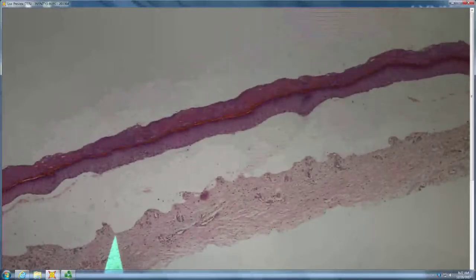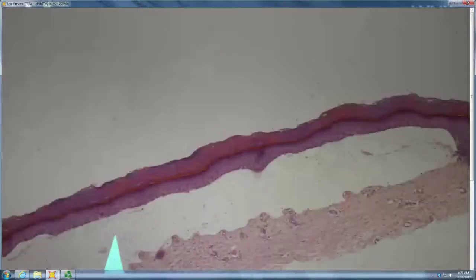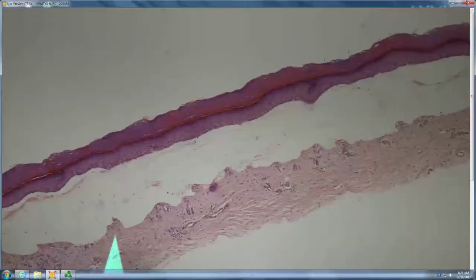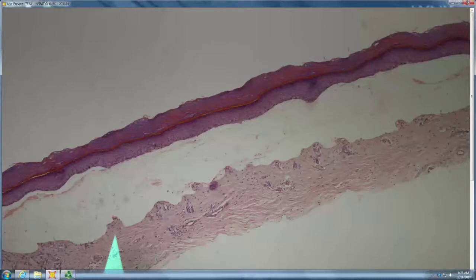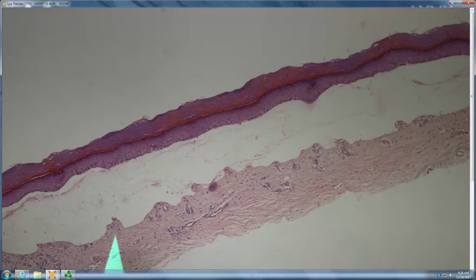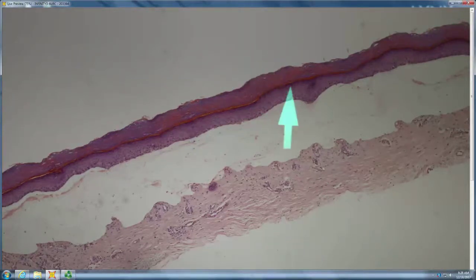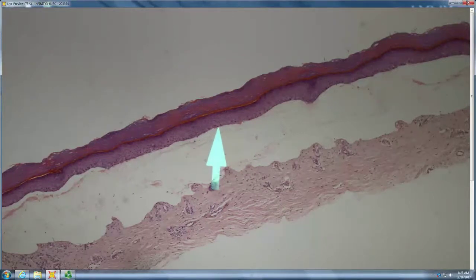It looks like we have a subepidermal blister with maybe some festooning. Yep. So subepidermal blister, maybe some festooning, makes you think of? PCT. Makes you think of PCT. It should be on acral skin, which the corneum looks like. Right? It should be on acral sun-damaged skin, and it looks like there's a little bit of solar elastosis in there. And then you look for caterpillar bodies, and there's maybe a little caterpillar wannabe there. And then you look for hyalinization around those vessels, because you always should have some hyalinization.